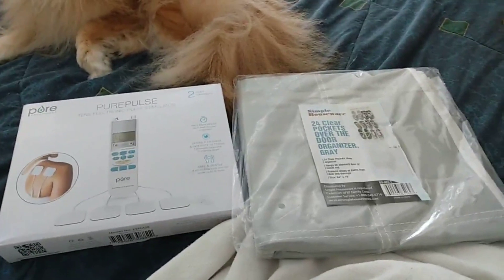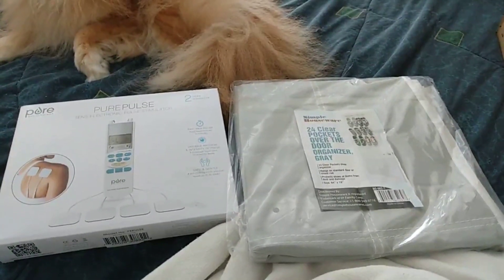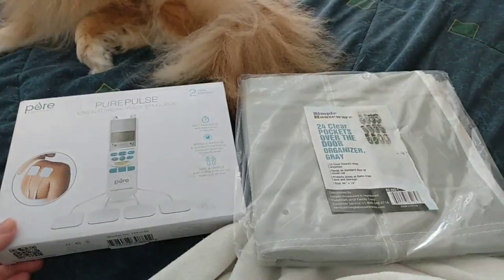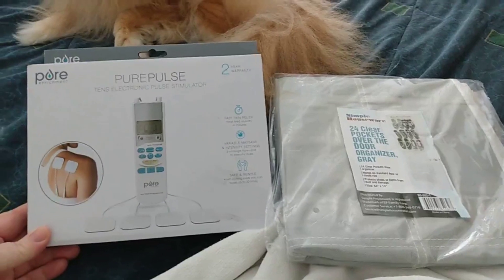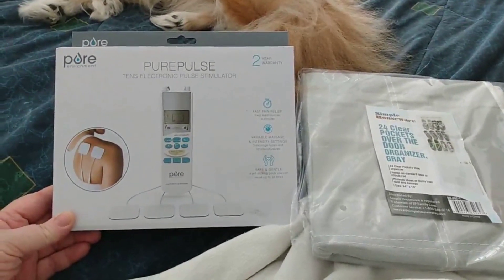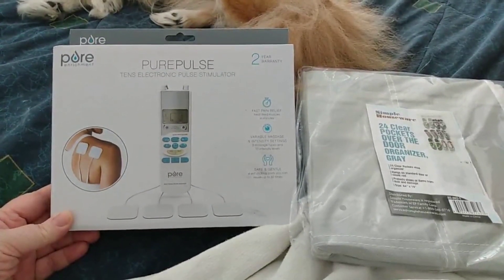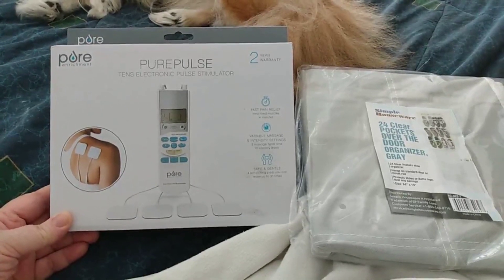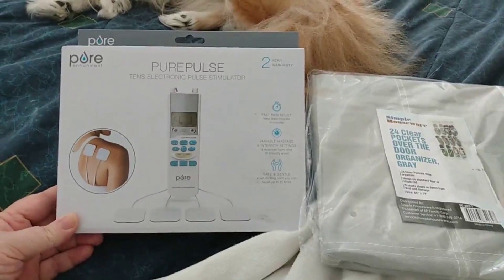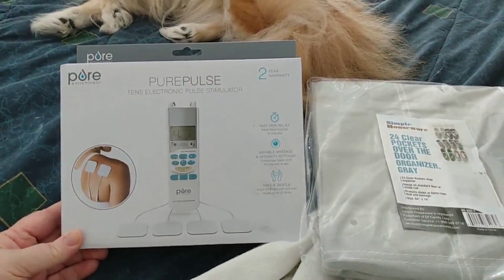Hello and welcome back to Disabled and Prepping. I'm hoping the fan doesn't interrupt my sound, but I need to stay cool. So today I got some preps. One is to hopefully help with my dystonia. I've been told it might help if I can get my muscles to relax a little bit more, and I was suggested to try a TENS unit. So I got the Pure Pulse TENS electronic pulse stimulator.